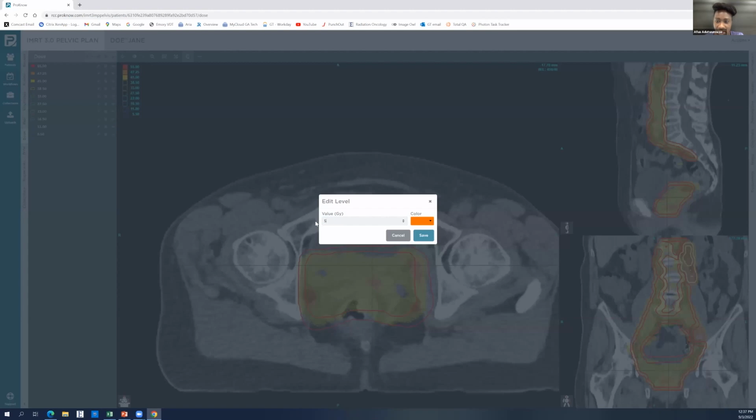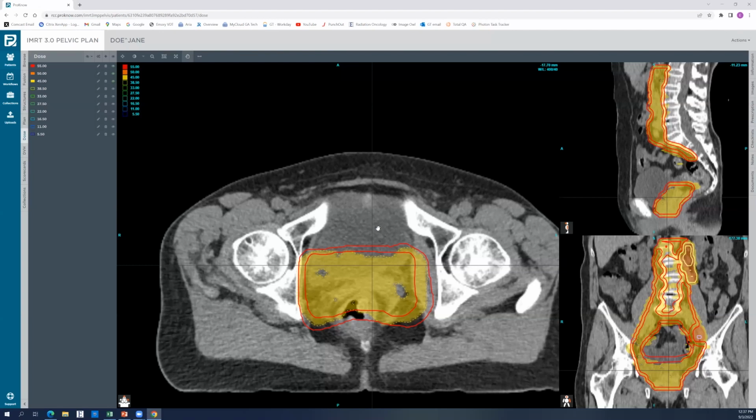A question, Kai? Yeah, you can ask your question directly. Okay, fine. Yes, go ahead. This line, are we creating it inside the PTV or outside? The ring is outside, right? No, the ring is inside. Inside. Is right inside. Inside the PTV. 5 Right. millimeters inside the PTV. So what Right. you're doing? What Yeah. about the line?